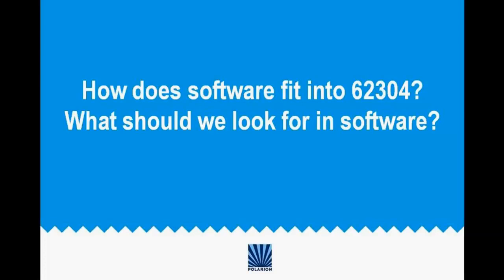For those of us that have been doing software development in a clinical context, it fit because we were also indirectly going to be considered for our role in that particular workflow. So any sort of medical data or medical device data systems, I know there's a rule out there for MDDS, and if you play a role in transmitting medical data, medical device data, et cetera, there's a role for that type of software categorization in this as well.